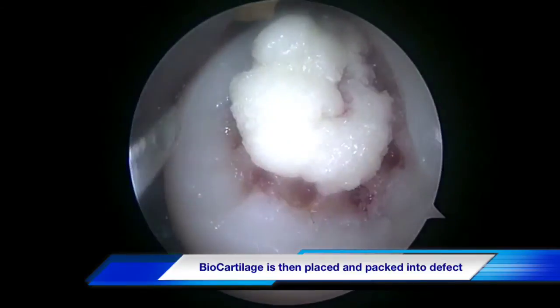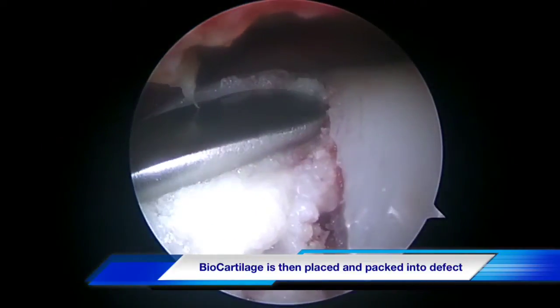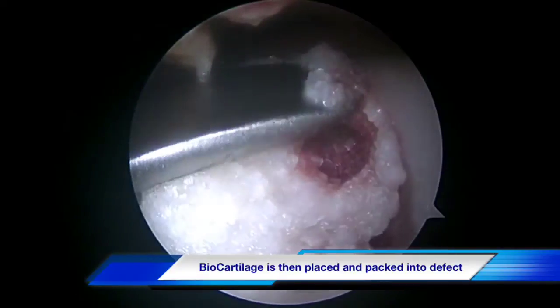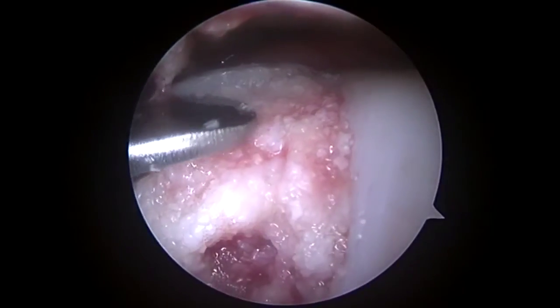The purpose of using the biocartilage graft is that it serves as a scaffold for your own native cells to populate, so that the repair cartilage that grows inside your knee is as normal as possible.